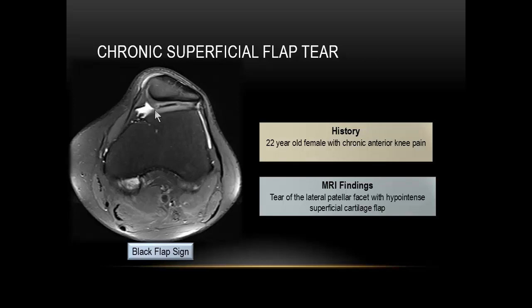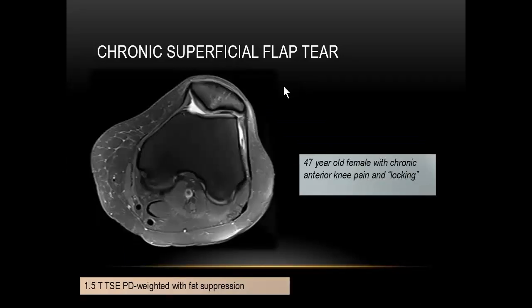This is a patient, you can tell, has had it longstanding, although she's only 22 years old, probably overloading of that lateral patellar facet from a patellar maltracking. We have fairly significant chondrosis within that lateral facet, the delamination type tear. So we can tell this cartilage is already damaged, but the structural drivers of that are really related to the patellar maltracking and the excessively tight lateral retinaculum.